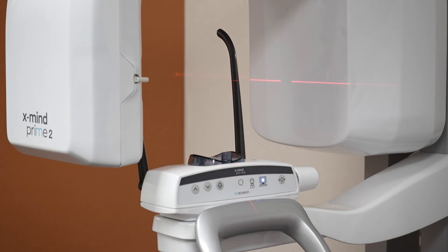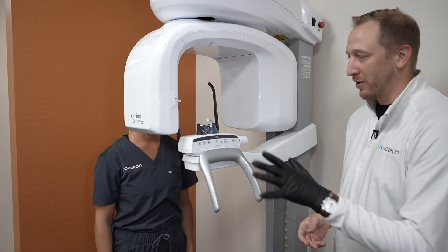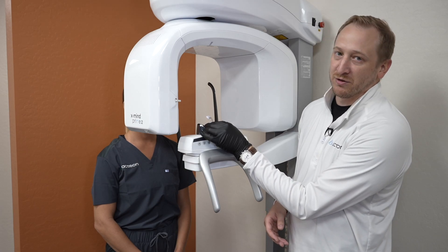So let's go ahead and get a patient in the machine and showcase how to get them positioned. I'm here with Sheridan to help showcase how we position patients. Notice the bite stick sometimes will get a little bit low as it drops into that cavity there — we may want to help the patient bite into it by lifting it up.